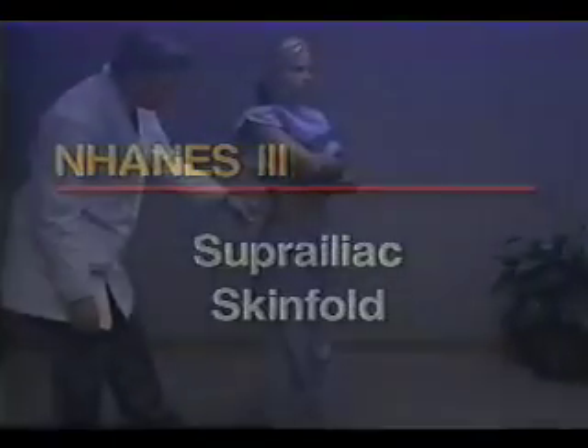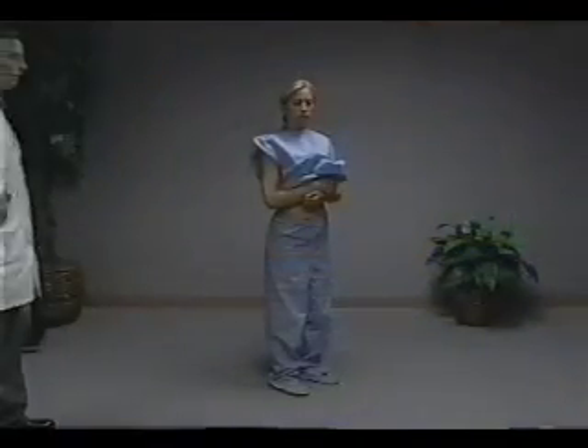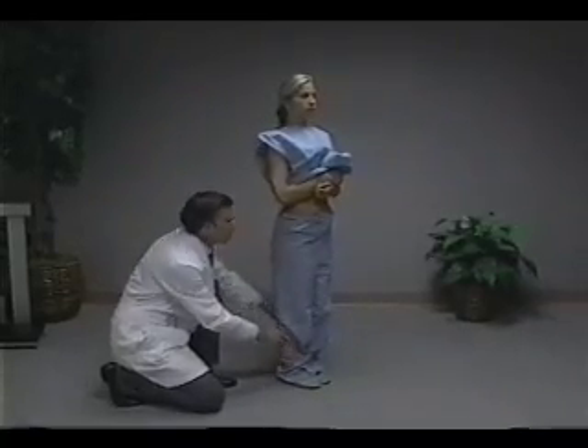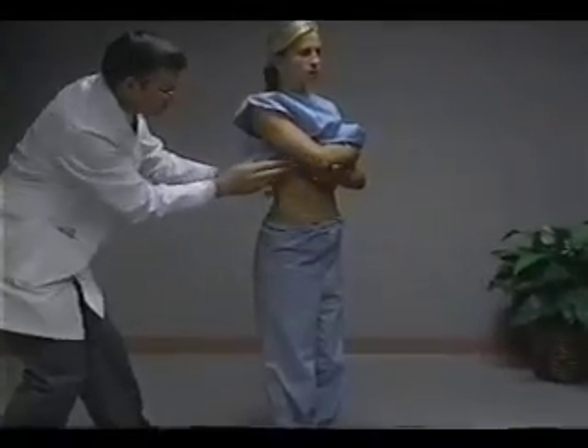The suprailiac skin fold is measured at a point anterior to the mark previously made to measure waist circumference. The subject stands in an upright position, with weight evenly distributed and feet together. The examination gown is held so that the waist area on the right side is exposed.